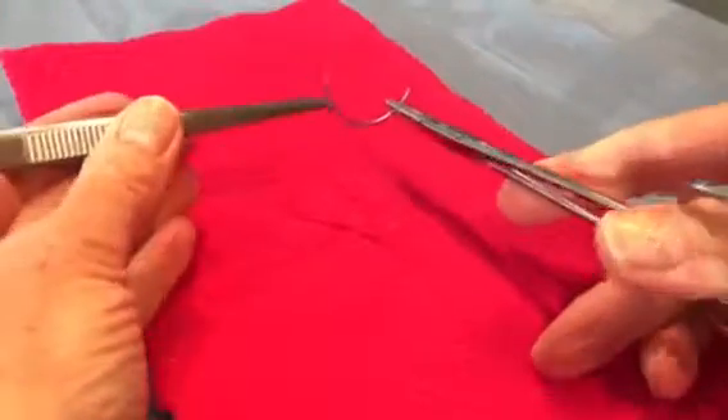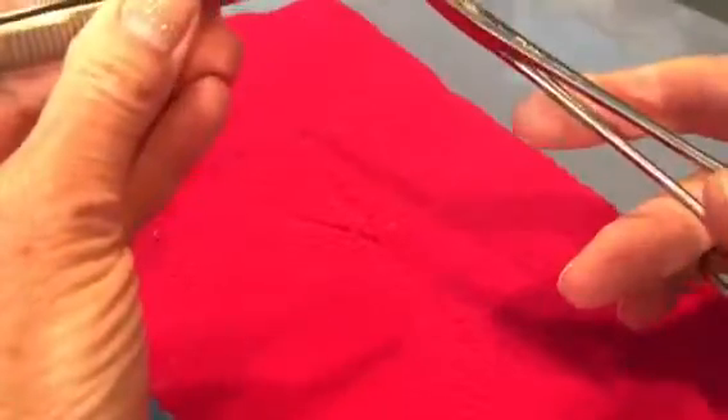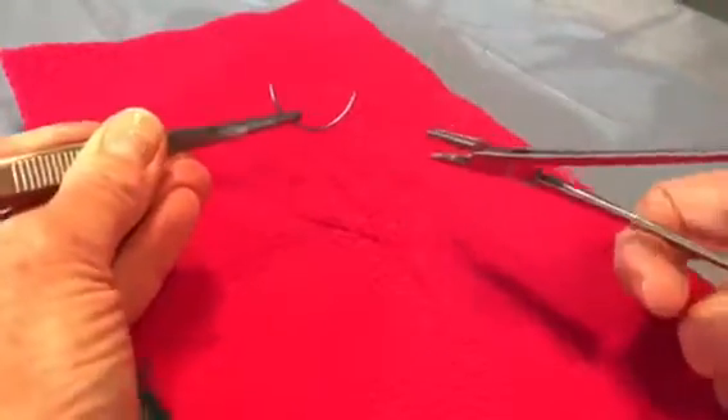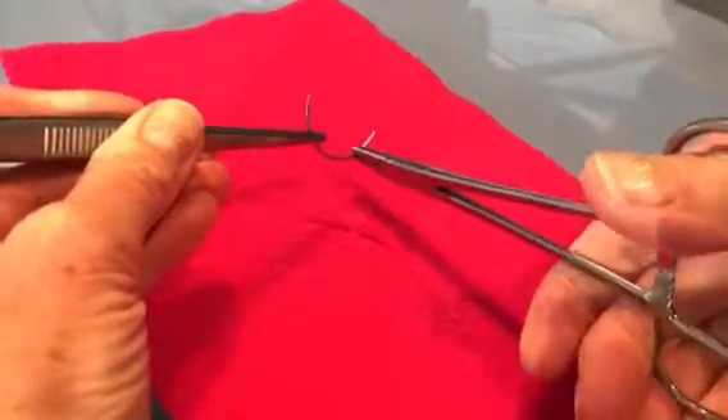The technique for transferring the needle is to grasp the needle between the arms of the tissue forceps and pull it, then re-grasp it at the tip of your needle holder.